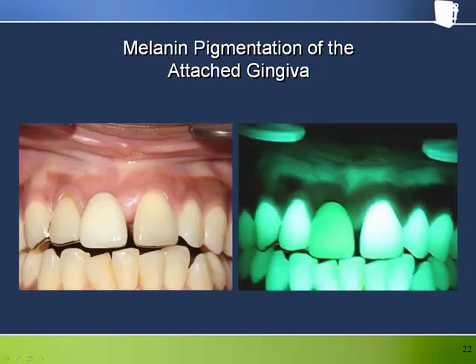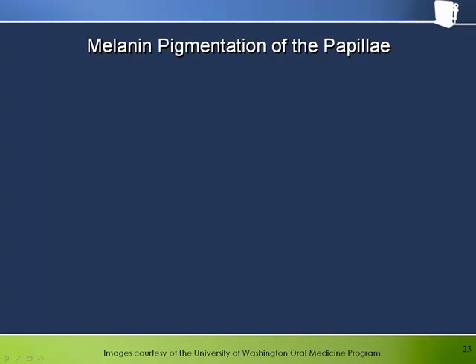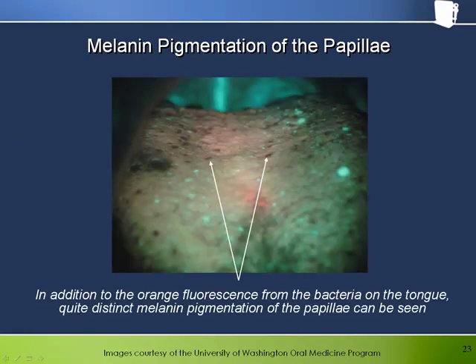Earlier we saw that the attached gingiva typically appear dark under Velscope, although they naturally appear pale pink under white light. Here's another reason they can appear dark under Velscope — in this case the same reason they appear dark under white light: the absorption of light by melanin. In addition to the orange fluorescence from bacteria on the tongue, quite distinct melanin pigmentation of the papilla can be seen under fluorescence, and as we might expect, the melanin pigmented papilla also appeared quite dark in white light.